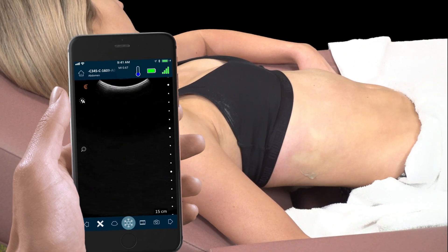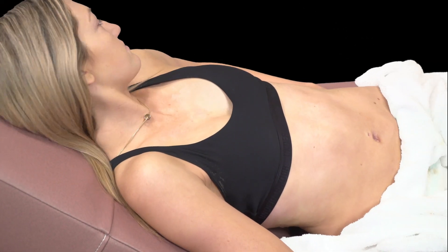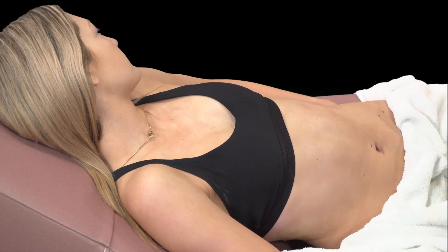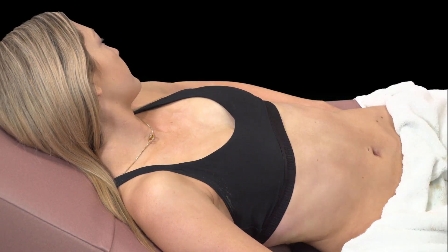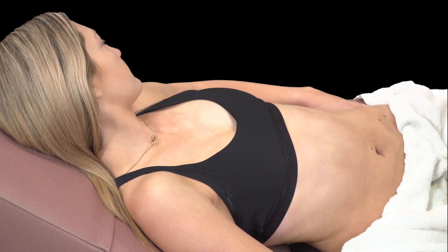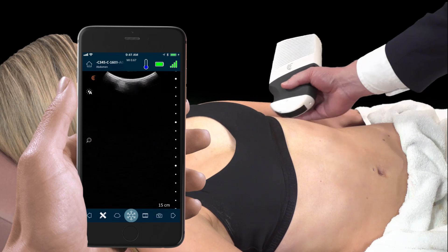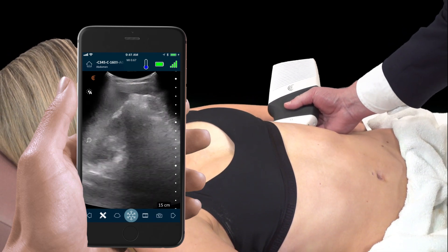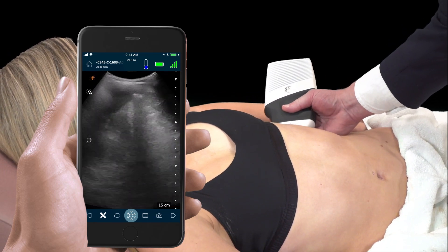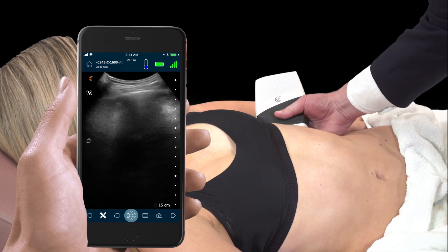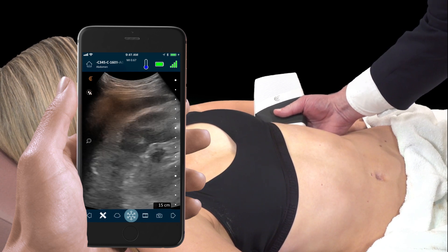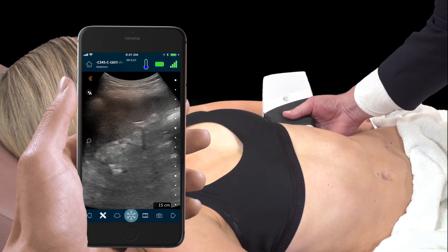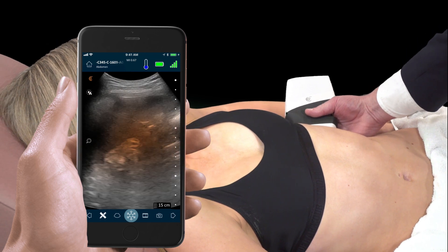Now we'll move to the left kidney, having the patient turn towards us. Again, the scanner is placed on the lateral aspect of the abdomen. Here we use the spleen as an acoustic window to examine the parenchyma of the left kidney.